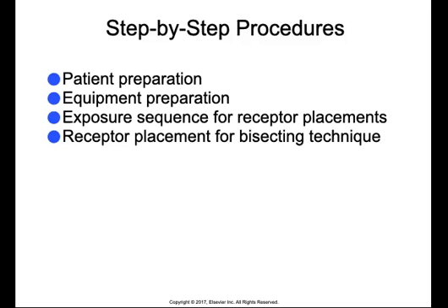Okay, again with patient preparation, just make sure that when the patient is seated, they are upright and both arches of their mouth should be parallel with the floor. Also, explain the procedures to your patient. Adjust the chair so that it is a comfortable area for you to work.